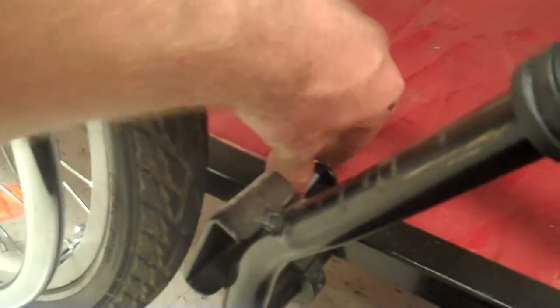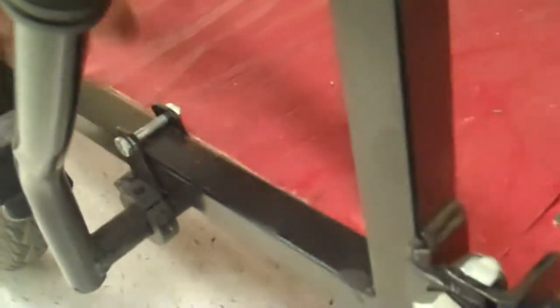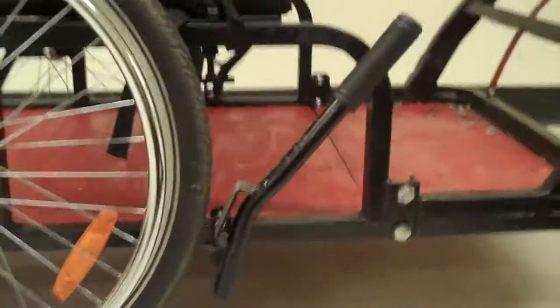This is the brake. It slides along this clamp, along this tube. There's a rotational stop that keeps the brake from falling too far forward, so you can still reach it. It looks about at that angle. That stop should be set so that if your finger gets caught in there accidentally, it doesn't get stuck. The brake needs to move with the axle.